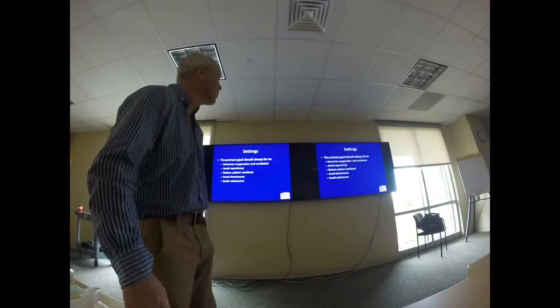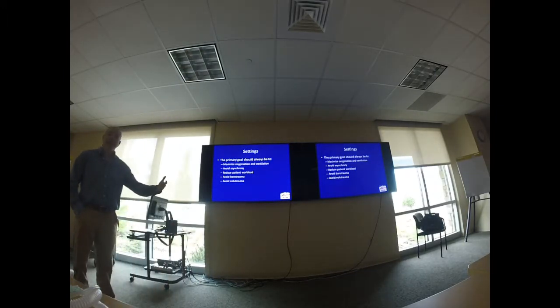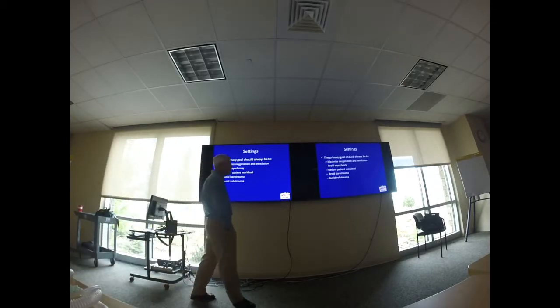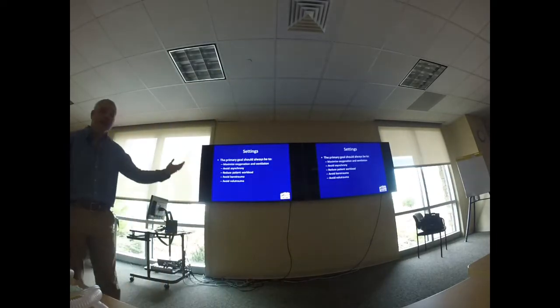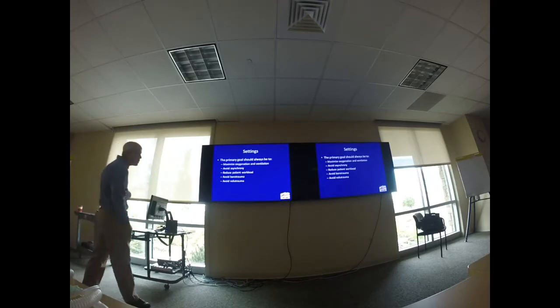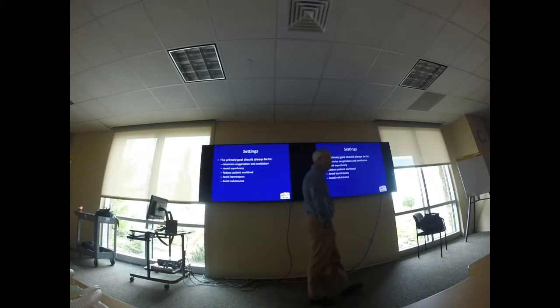And now what we're going to do real quickly is just set some patients up on the ventilator. Okay? So we're going to just go through settings. So these are the primary goals. And this is just what you should do with any patient that you're putting on a ventilator. You should always try and do all of this stuff. So optimize oxygenation and ventilation, avoid asynchrony, reduce their workload, avoid baro and volume trauma.